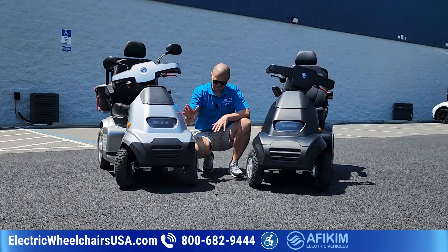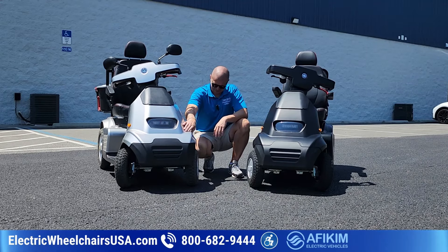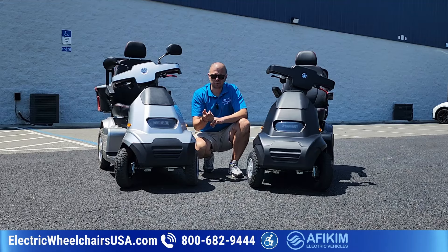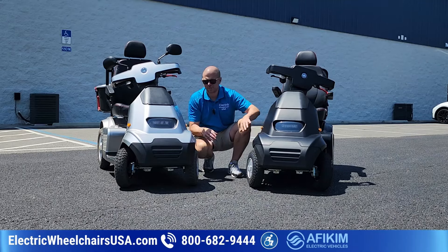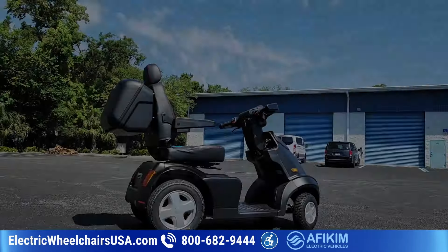This is the silver color so you can see the difference and contrast. The silver and all the other colors — whether it's silver, red, blue, or gray — the color kind of pops because it's shinier. The matte black doesn't have that glossy finish. A lot of people like that, so that's why Afkim came out with this.